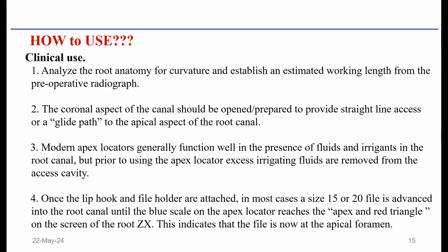and everything. And then we take the help of an apex locator to confirm our idea that it should be 23 or 24. So it might be 22.5 or 23.5 or 24.5. So it will be in that range. So you cannot blindly go with an apex locator saying that, okay, the apex locator is showing the reading as 15. So you should be doubtful that it might not be a correct value.